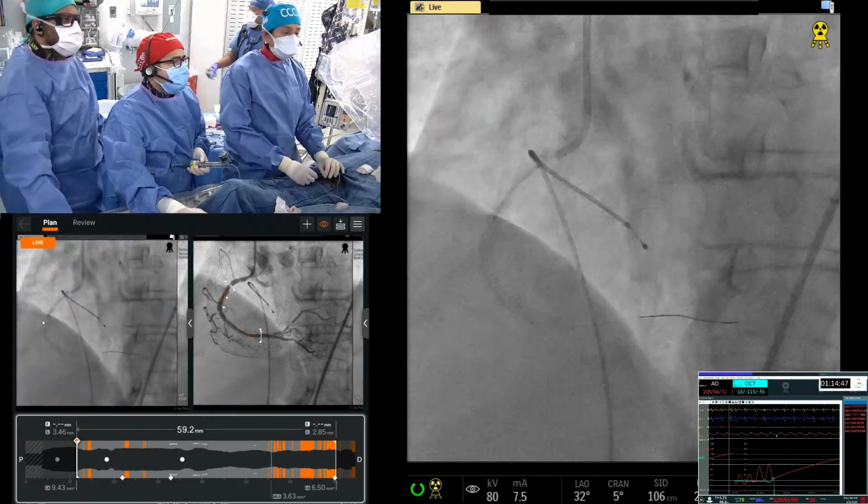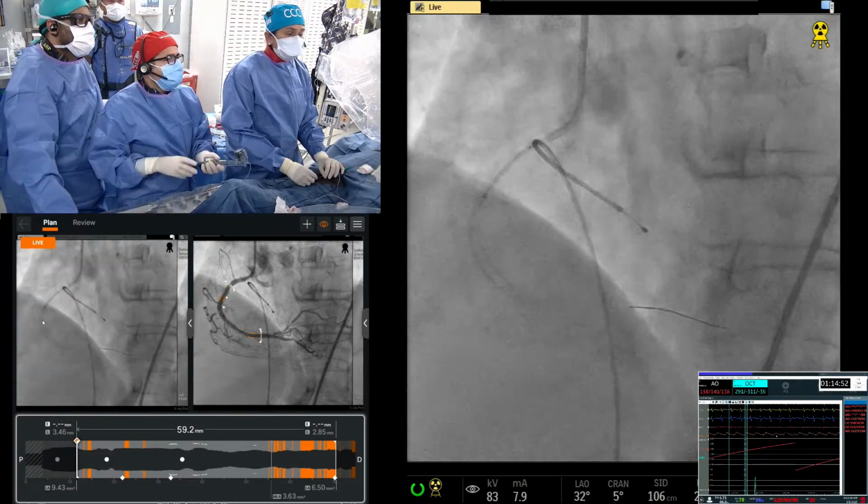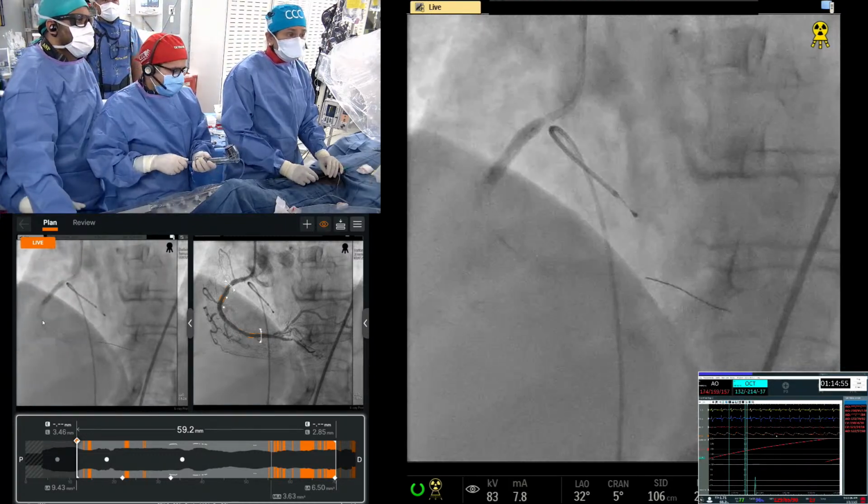As long as you know the clearance is good. Yes, okay, go. Right, Kiski? Yep. Is there anything else you want to add?